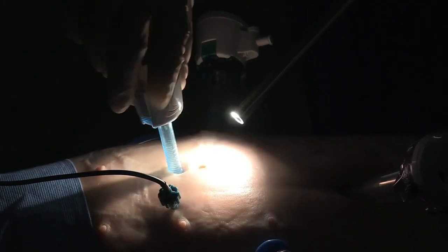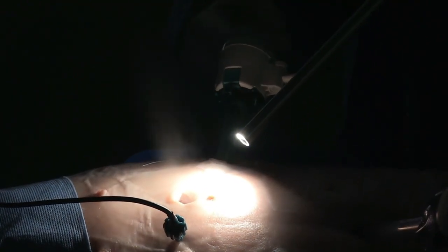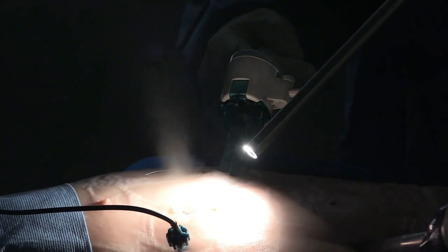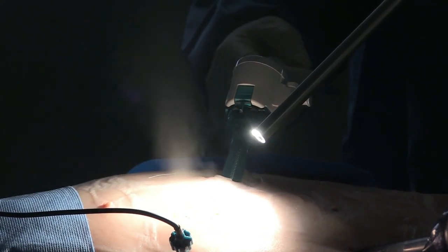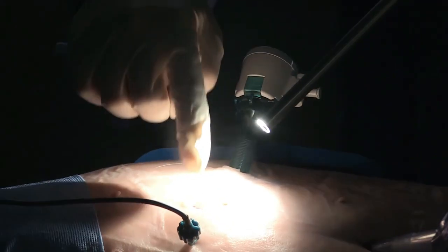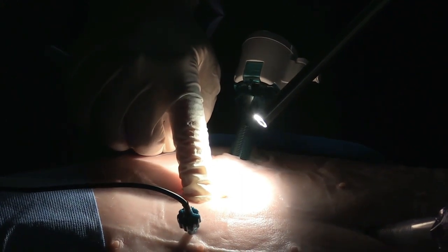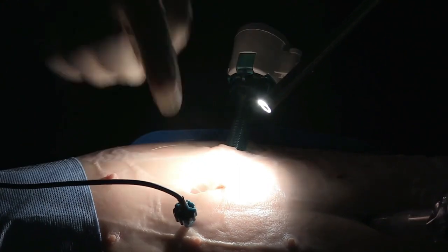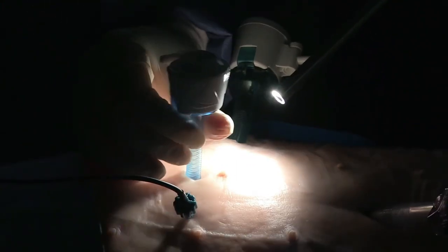This video intends to support the guidance by professional bodies regarding mindfulness and care in the management of smoke during laparoscopic surgery, and also illustrate other means of how aerosols from laparoscopy can contaminate the operating room, reinforcing the need for effective personal protective equipment throughout the pandemic.